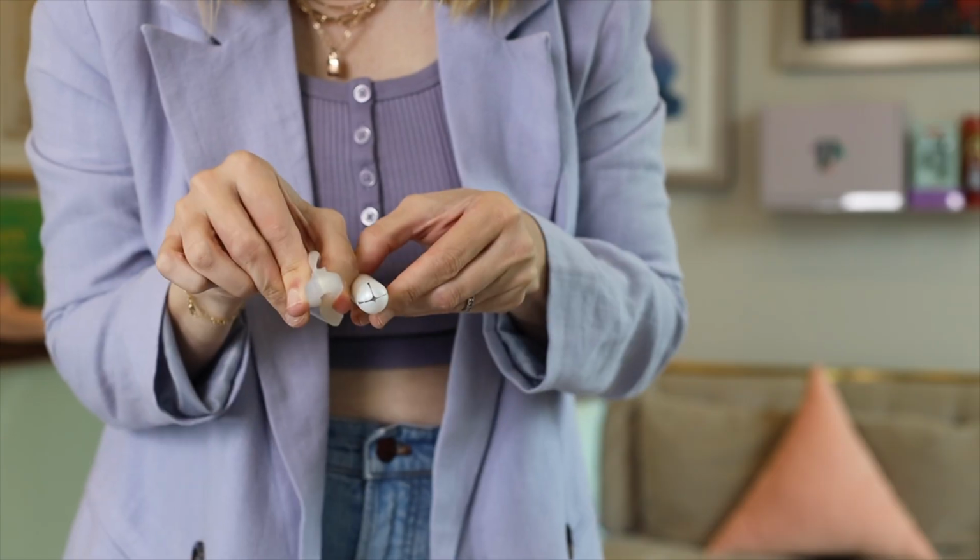And I say that because vaginismus is the over-tightening of the vaginal muscles. It is in response to inserting something, whether it is a physical response or a trauma response. You're trying to insert something, and your body is saying no. So menstrual discs can insert really, really narrow, and particularly this Flex Disc I'm using as an example gets really, really narrow. And so it can go through with lubricant, for sure, through that narrowness, through that tightness into the open space of the vaginal fornix.